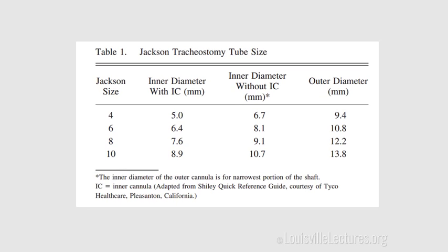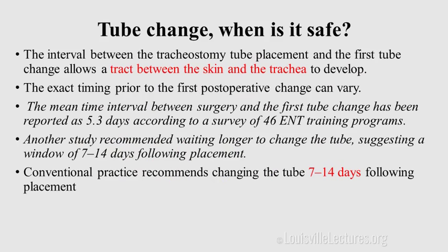These are the diameters of the tube. We usually use anywhere between 6 and 8. The internal diameter is very close to the number written on the Shiley catheter, so you should know what size you have, especially if you are going to change it — you should use the same size.